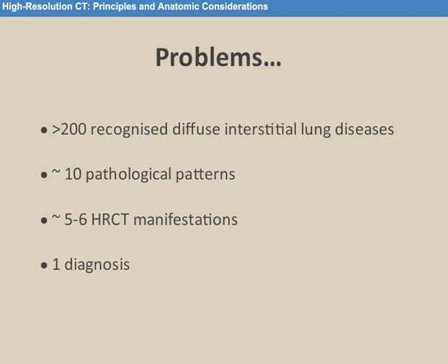But that, again, is not quite the biggest problem, because the biggest problem is the clinician who comes along and says, I want one diagnosis, and that's when we run into problems. So that's why diffuse lung diseases are so difficult.